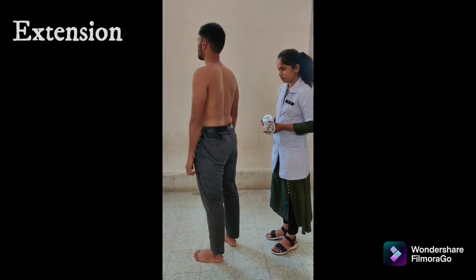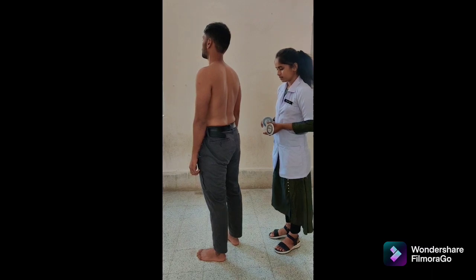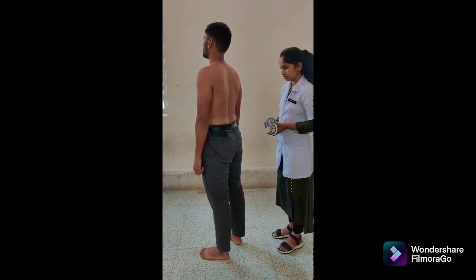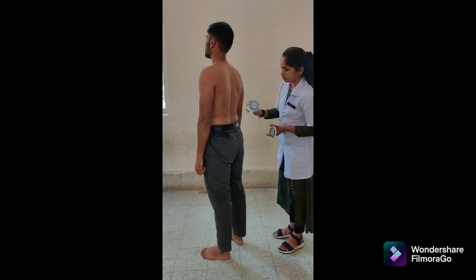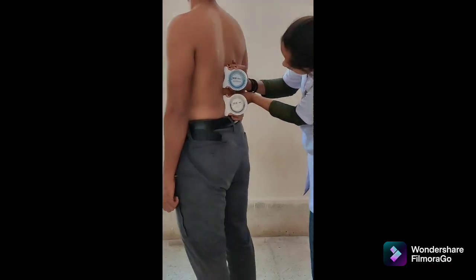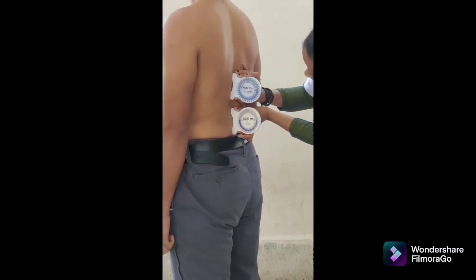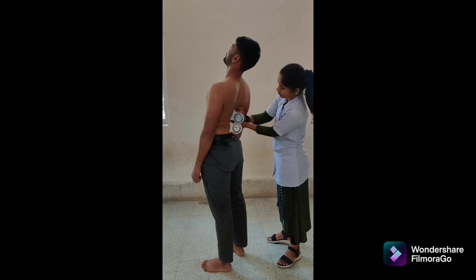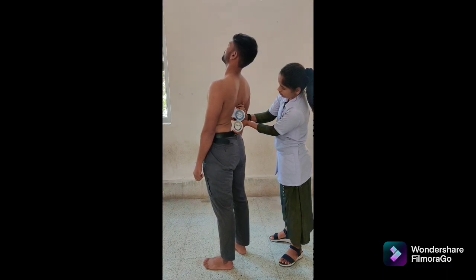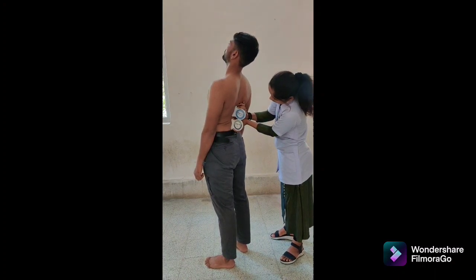There are three methods to measure lumbar extension. First is double inclinometer. Patient position: standing with feet shoulder-width apart. Inclinometer alignment: place one inclinometer over the spinous process of T12 and the second over S2. Both adjusted to 0 degrees. Instruction: bend backward as far as possible. Maintain the inclinometers against the spine during the motion. Read and record degrees from both inclinometers at end of motion. The difference between both readings is the lumbar extension range of motion.